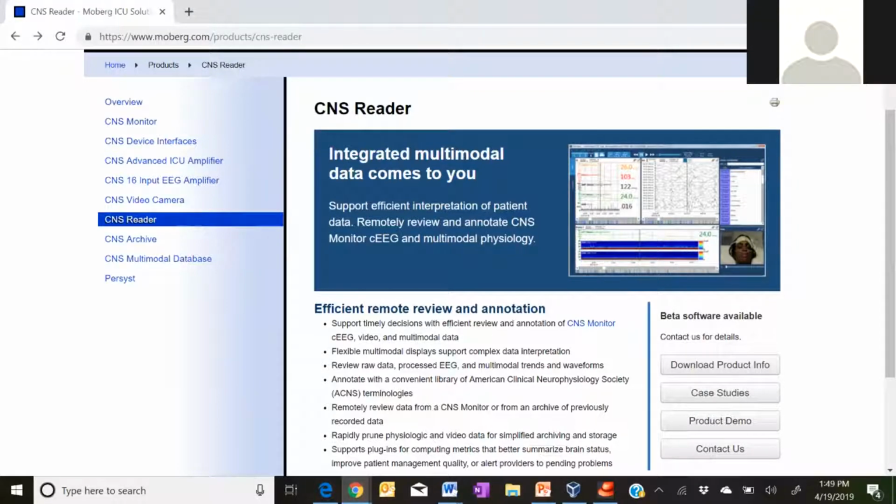And since we put that data into our patient monitor, we can go back and do a review and set those parameters of how much time the baby stayed between our target temp, and how many hours. You can set the time window for the last shift, the last day, or the entire duration of cooling, 72 hours.